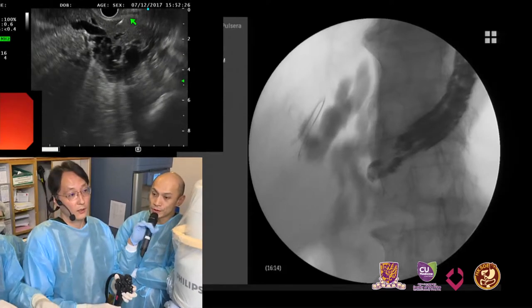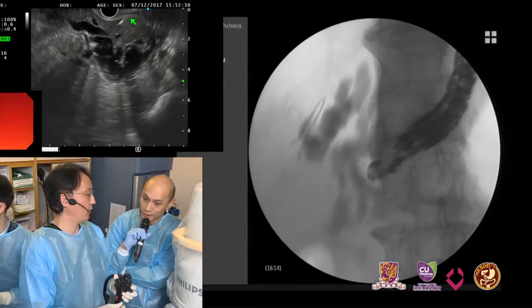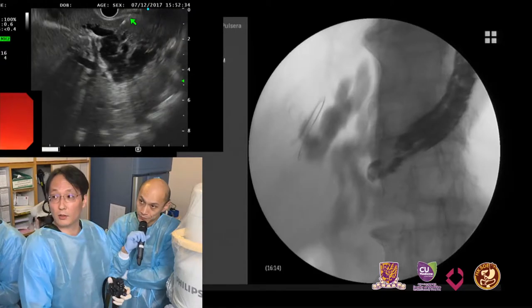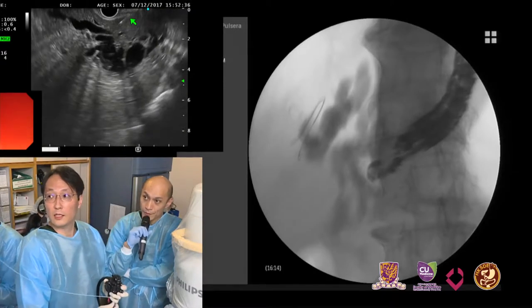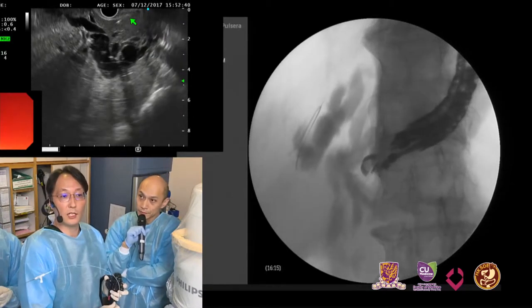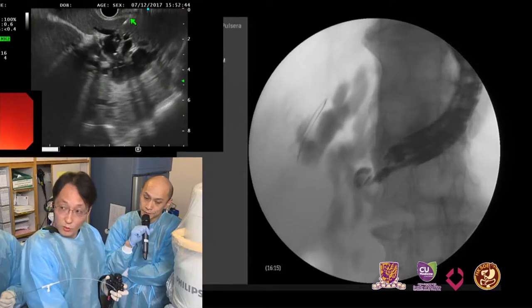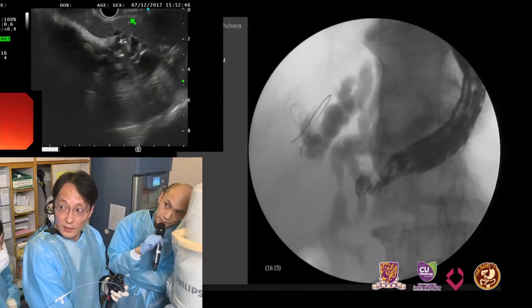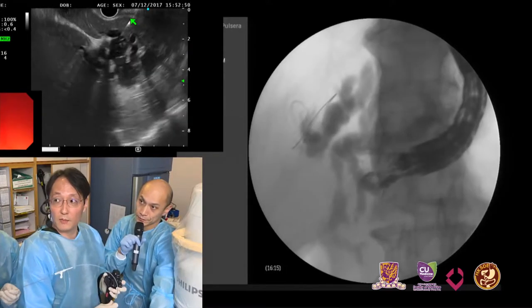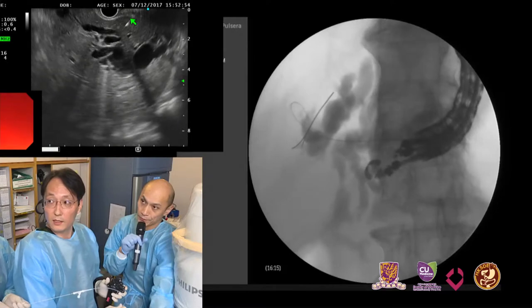So do you use the same stent for choledochoduodenostomy? A little bit different design for the tapered tip, but there is a more needle type in the choledochoduodenostomy. Okay. Then we deploy the stent with the intra-channel release technique. For stent deployment, the scope should be fixed and a little bit pushed is better, because it's very important. Sometimes we lose the route of the line.